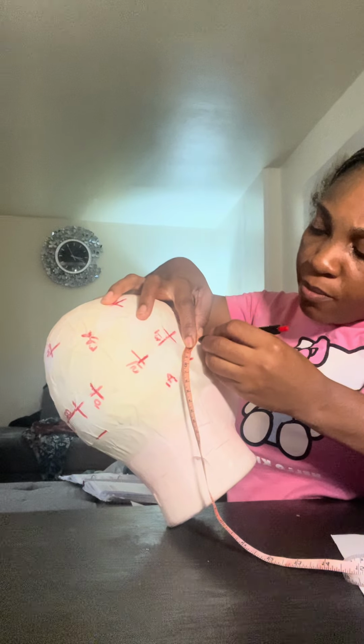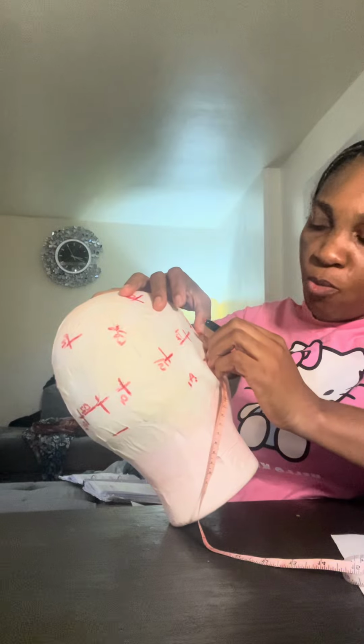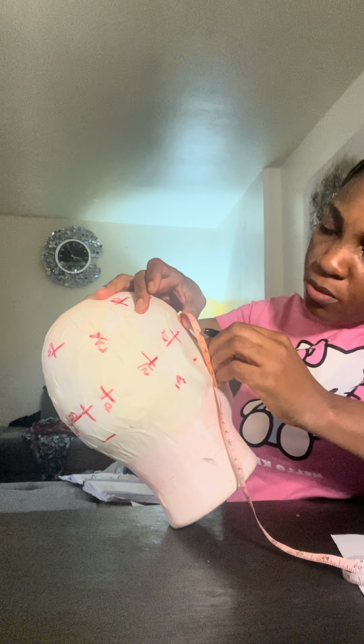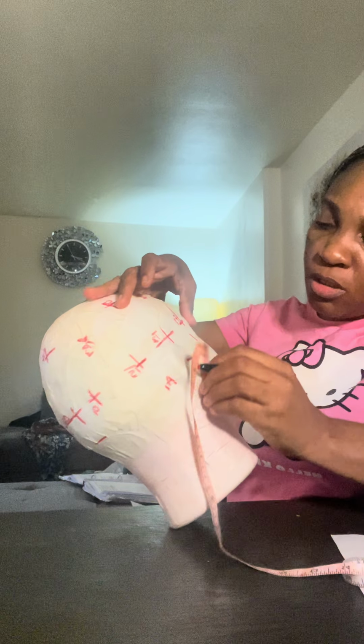Then from the 2 centimeters upward 1 centimeter, putting my tape 1 centimeter up, which is my T1.